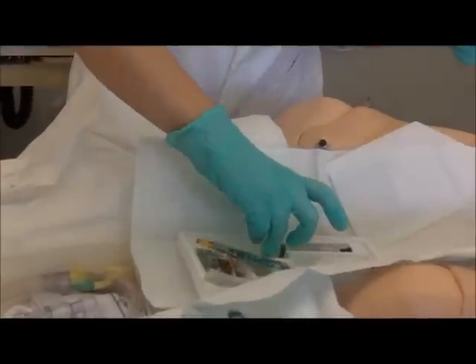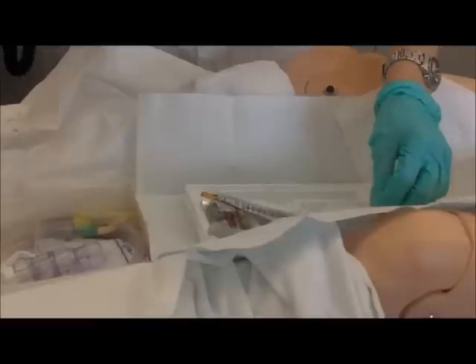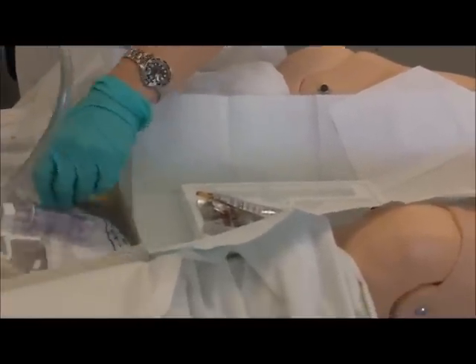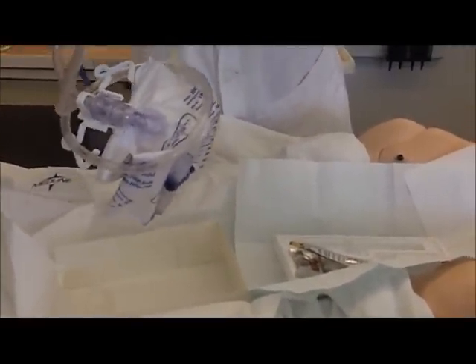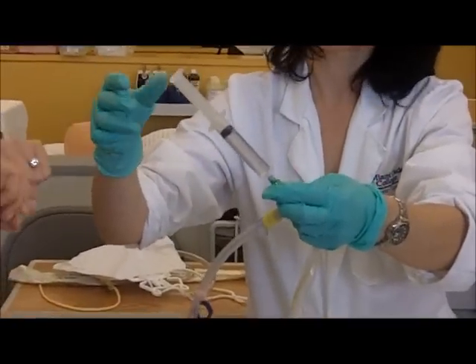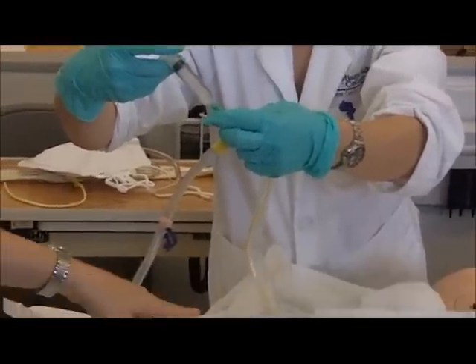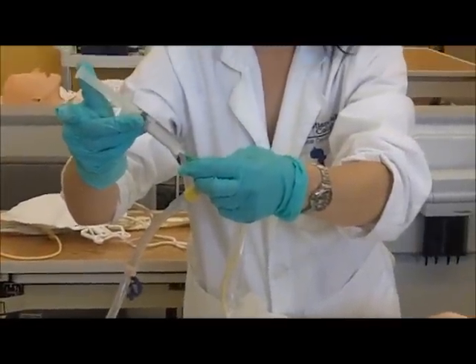Now the next thing you do is you need to grab your syringe. Your syringe has 10 cc's in it. Take the cap off. And you can throw it here or there, that's fine. So now you need to test your balloon. I told you the ones that we normally have are the ones that screw on so they don't come off. You can go ahead and try to test it. Sometimes it does squirt back at me, but go ahead. You're testing the balloon. Okay, let it go. Let it come back. Good enough. Let it come back.